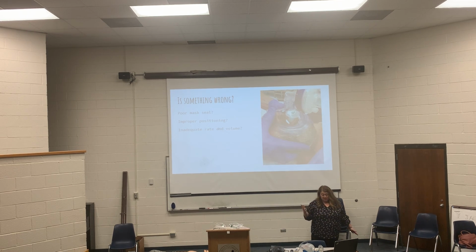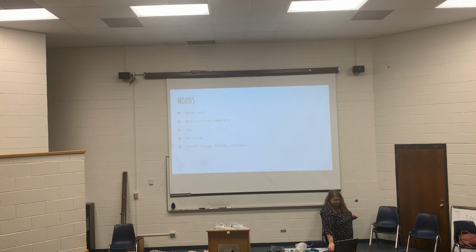And if that's on, is it an inadequate rate and volume? Are you only squeezing this bag like this? Because if you are, you're not giving him enough oxygen. Or are you squeezing too much? If you're doing this, you could have popped his lungs. I mean, that's just how it is. So just go over, recheck everything.